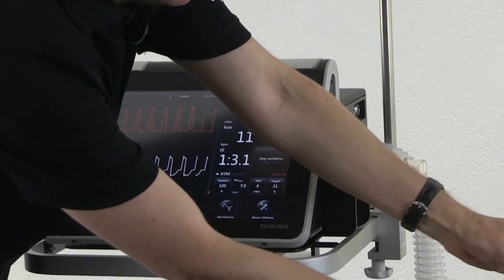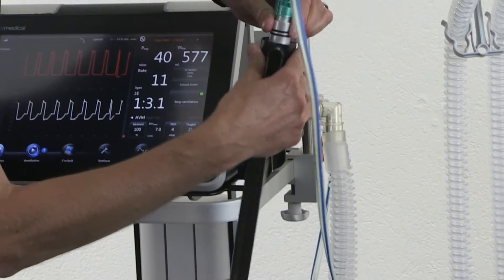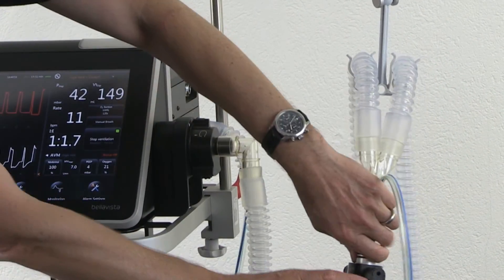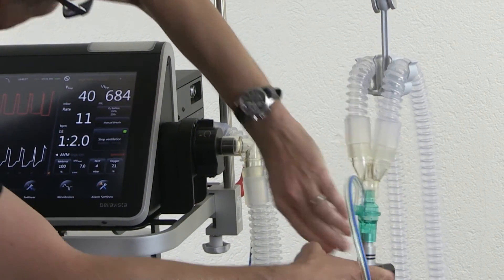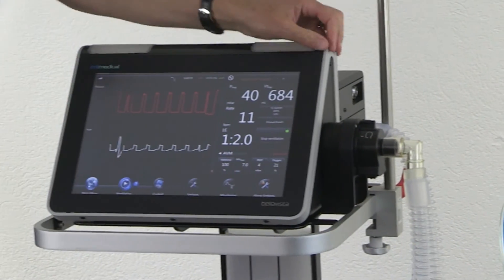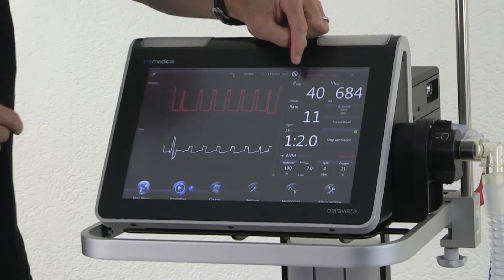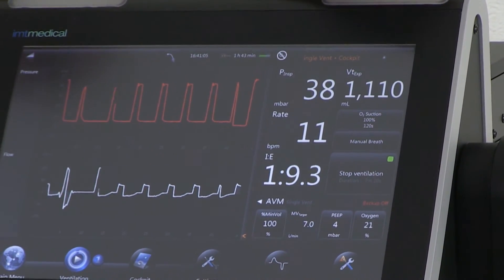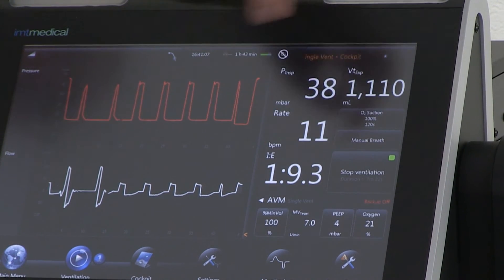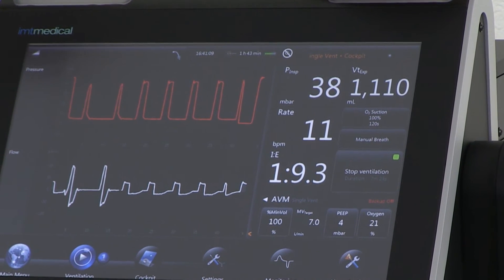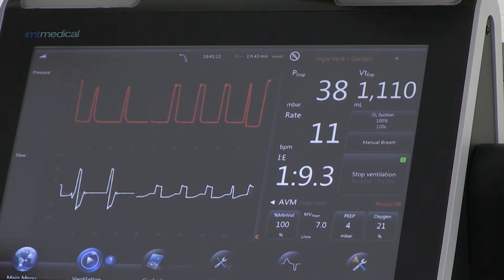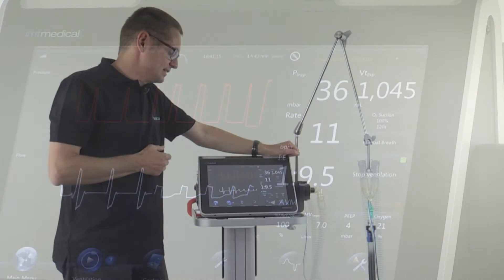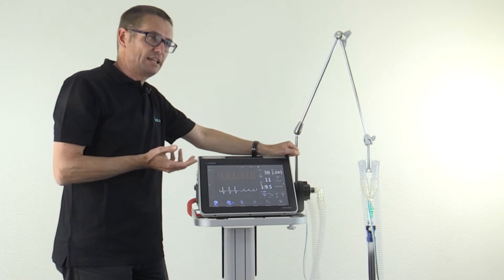On the way back, I'm reducing the resistance again and let's see how AVM reacts to that. It will immediately drop inspiratory pressure, drop tidal volume, and go back with the I:E ratio. So we have seen how AVM automatically regulates the ventilation.